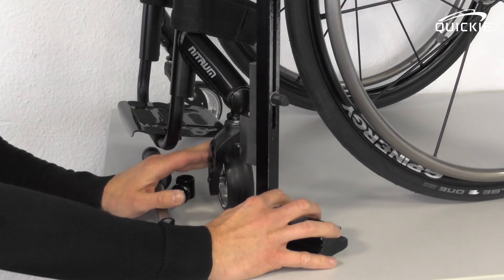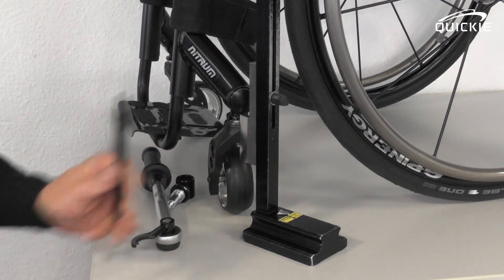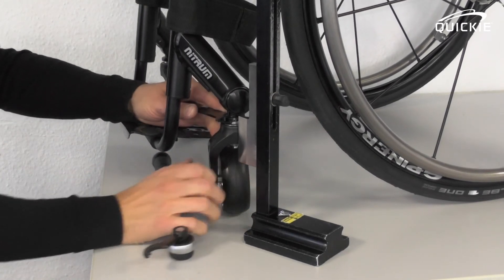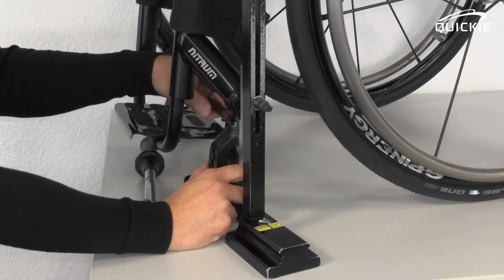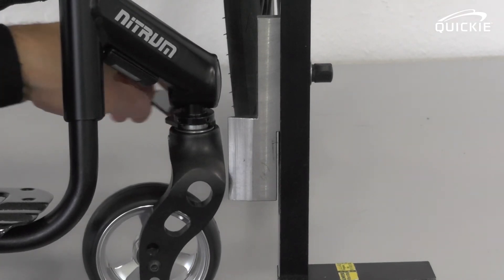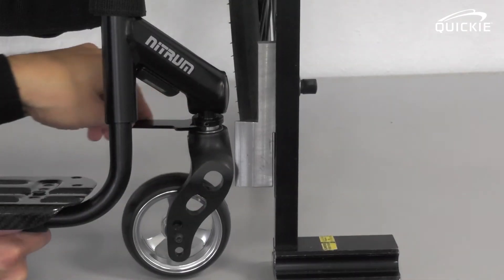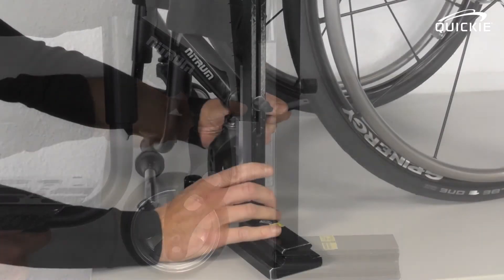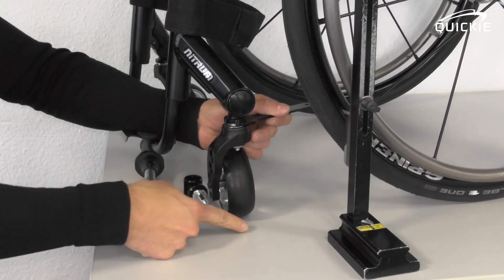Hold the gauge against the flat spot and you will probably find that it doesn't align. Use the spanner, insert it and turn it by a maximum of 90 degrees, and you will see the caster fork moving to the sides. Adjust it so that it exactly aligns with the 90-degree gauge, meaning that this plane has a 90-degree angle to the floor.